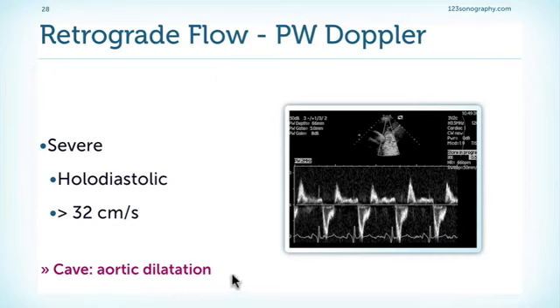One thing that you always have to be careful with is in patients who have a dilated aorta, because in those patients these values might not apply simply because the aorta is very wide and therefore the amount of blood which regurgitates spreads, and therefore the velocities might not be as high, and it also depends very much on where you place the sample volume to get these spectrums.